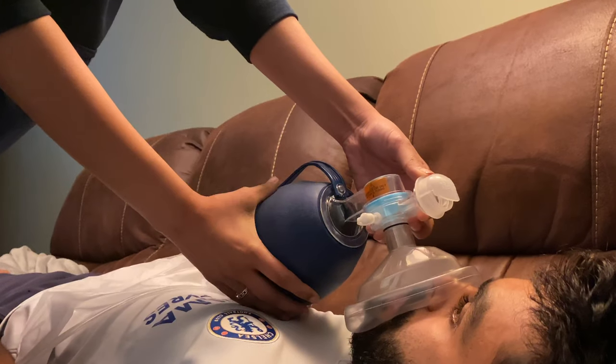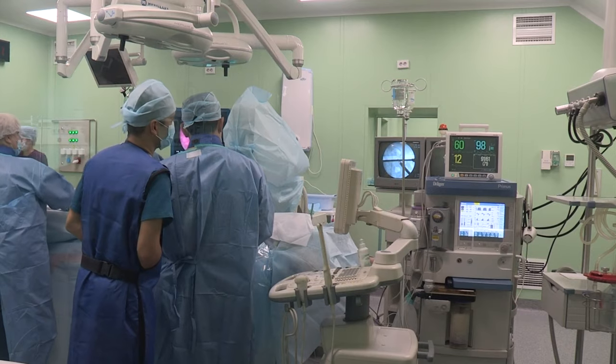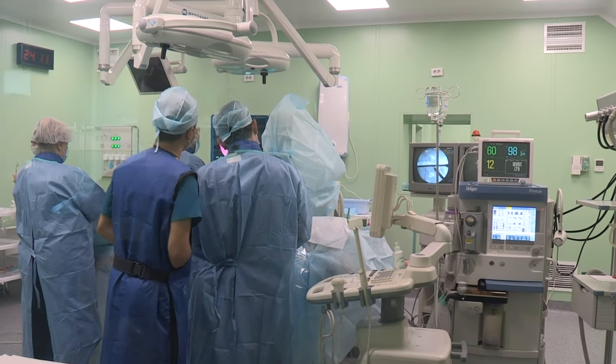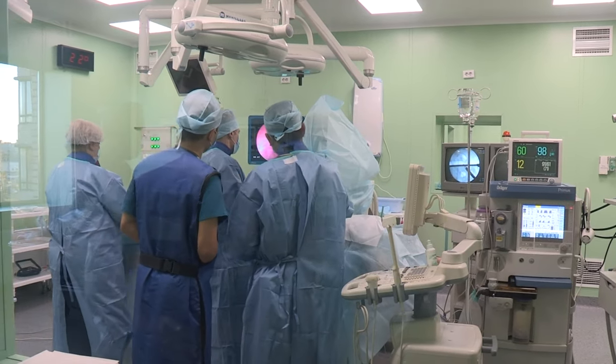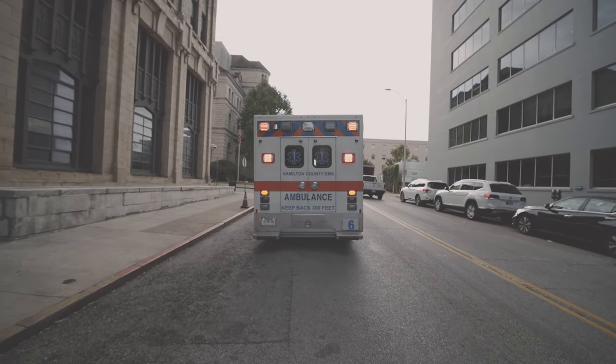While using the bag valve mask, medical health professionals would have to constantly compress the bag for as long as the patient needs it, which could be days together. As you can imagine, this is gruesomely tiring and will further drain the already exhausted and understaffed medical team.